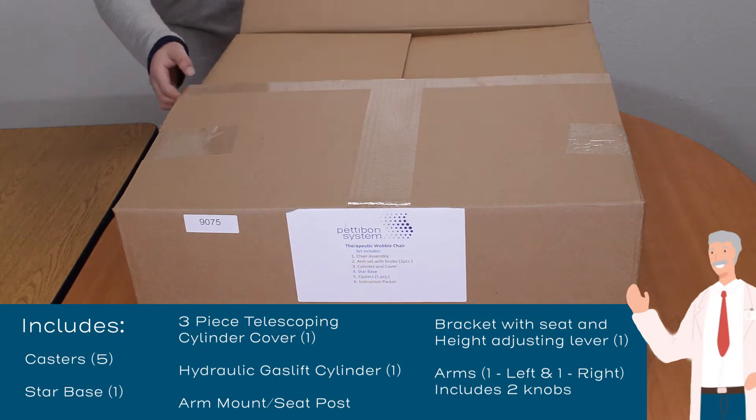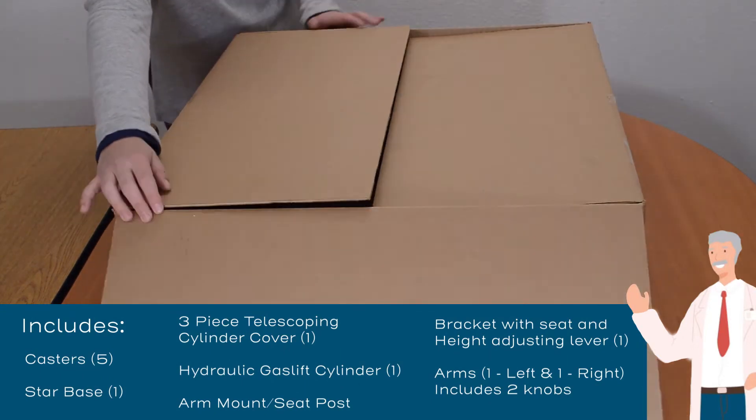When you receive your wobble chair, take inventory of all pieces listed on the directions sheet.